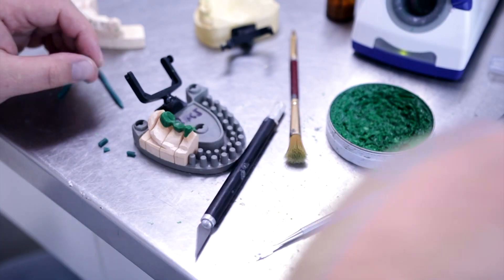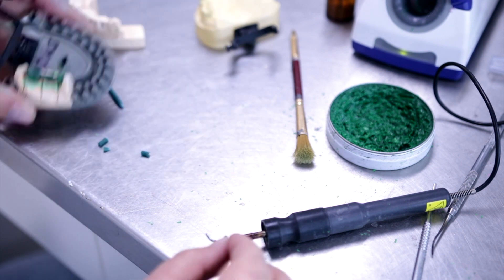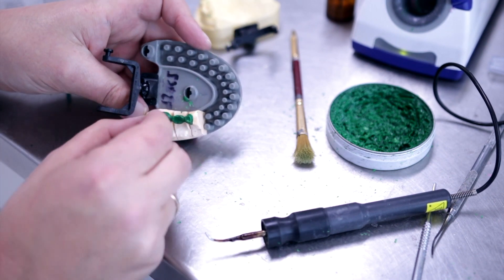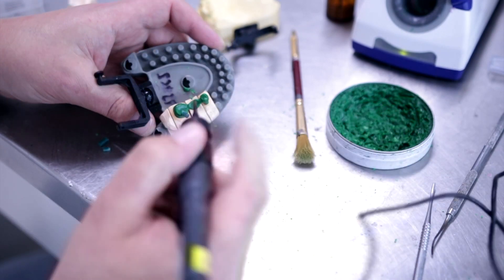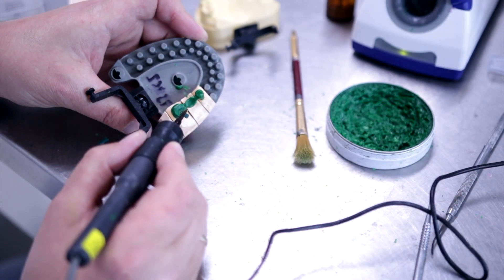To invest your restoration, you need to select and place the correct sprues. Use a 3-5mm thick sprue and connect it to a 5mm thick bar.